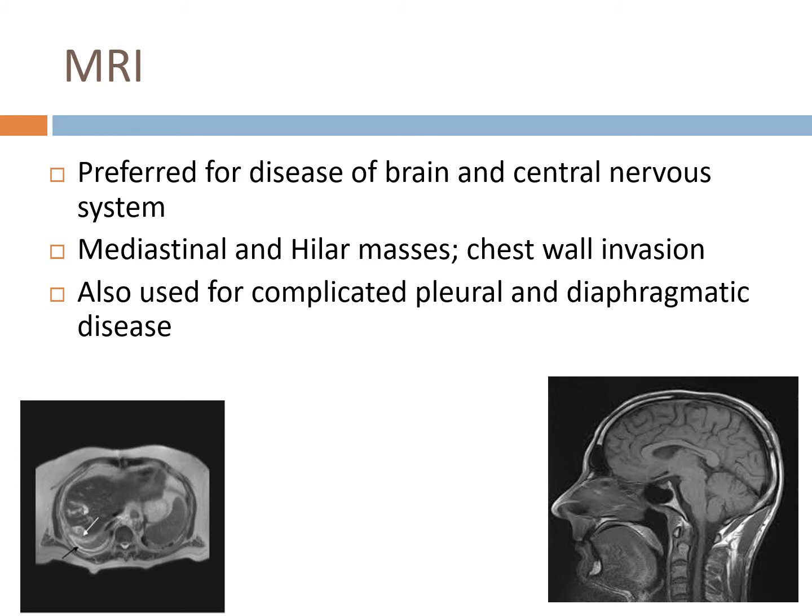Any time I'm going down there, it's because my patient's on a vent, so I have to make sure everything is changed, even their pulse ox probe. Everything needs to be changed. So the breathing is fairly well controlled. We usually sedate them for the procedure because it's so loud, and they have to have earplugs in.